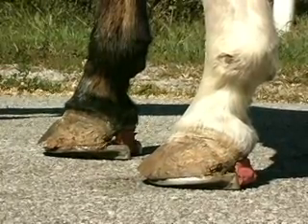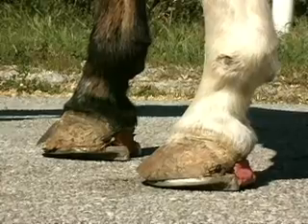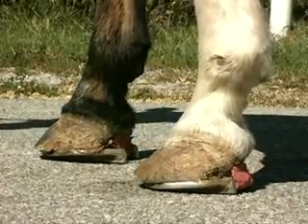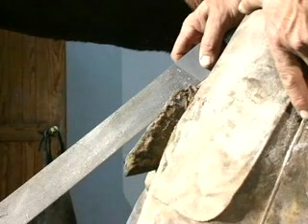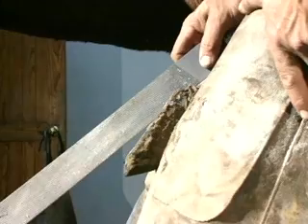We're taking a look at the overgrowth at the front. You can let the foot hang over all you like, so long as you don't pin the shoe to the foot in the front. The rasp is sitting in exactly the plane I want the shoe to sit. We must use the posterior part of the foot and unload the front. Miss Mary has been draining out both soles due to penetration for several months.